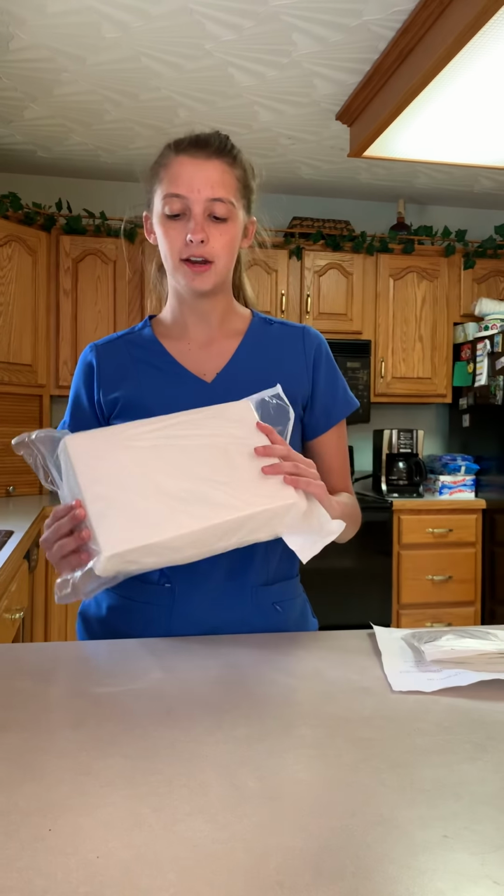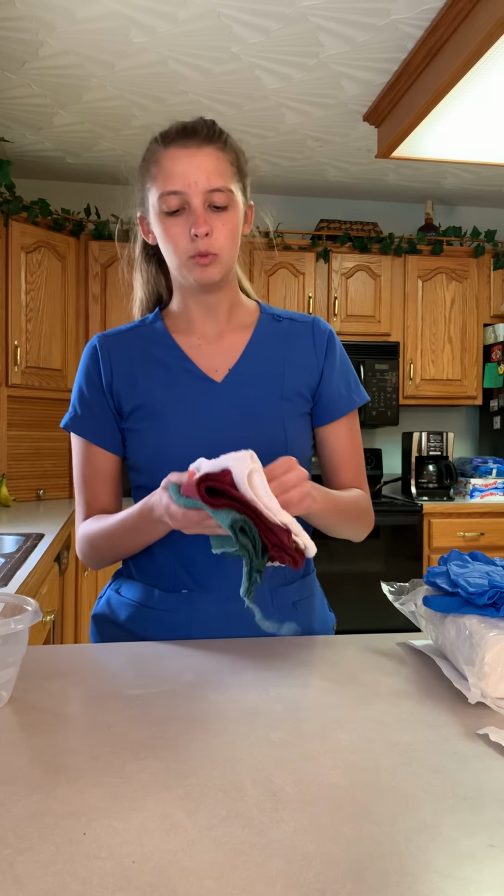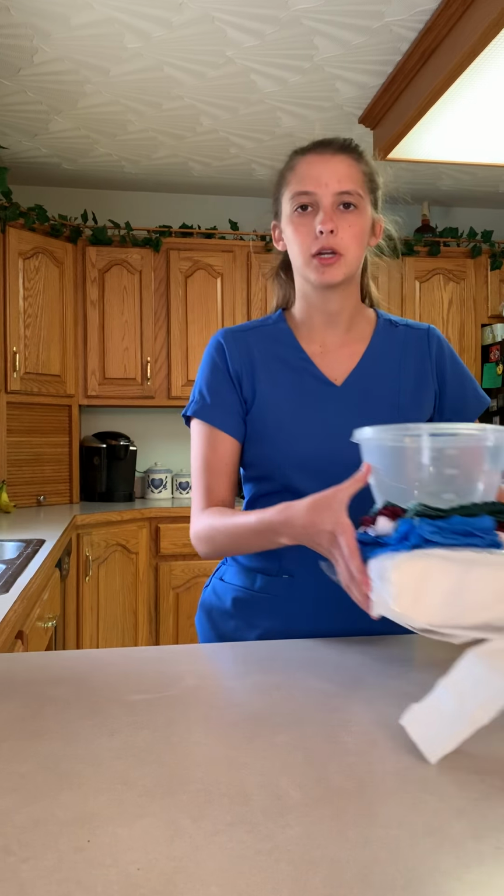First, I'm going to wash my hands. Next, I'm going to gather all of my supplies. So I have my healthcare provider order. I have my non-latex gloves that are sterile, unopened, intact, and unexpired. I have my sterile catheter kit tray that is unopened, intact, unexpired, and sterile. I have my clean gloves that are intact, and I have 3 clean washcloths, and I have my basin filled with warm water and soap. So we're going to gather all that up, and we're going to go into the patient's room.